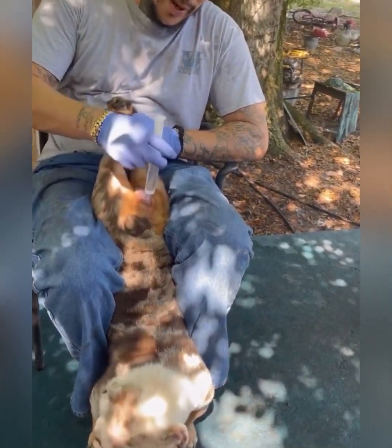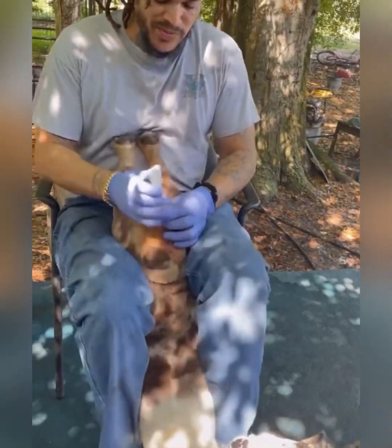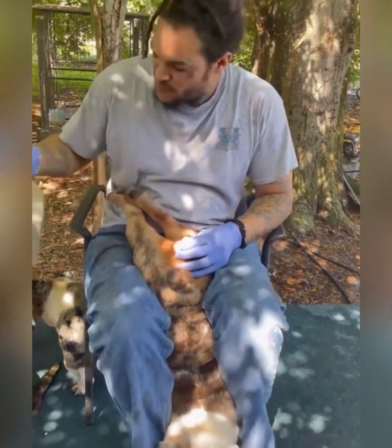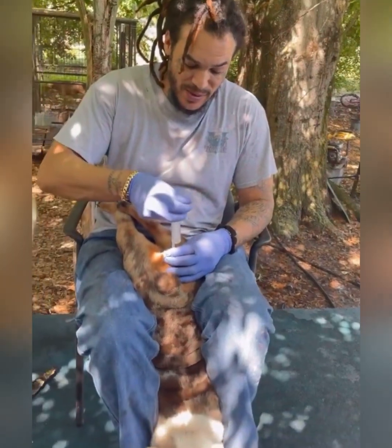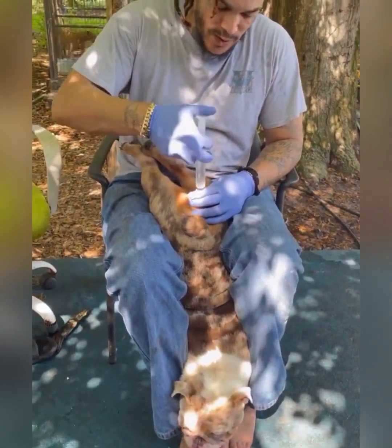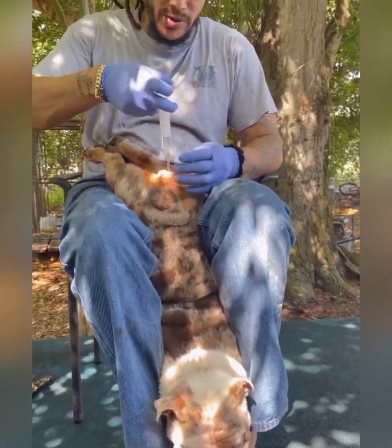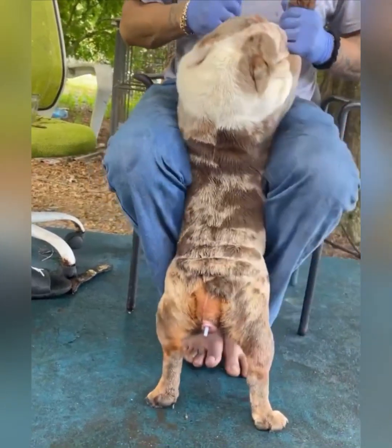What I've got in here is sterile saline water mixed with gentamicin. What you're gonna do is flush her uterus out — I use 250ml of saline water. It's about to start splashing back at me, and again this is to flush her uterus out. After you put all the flush in, saline kind of just squeeze on her sides a little bit.